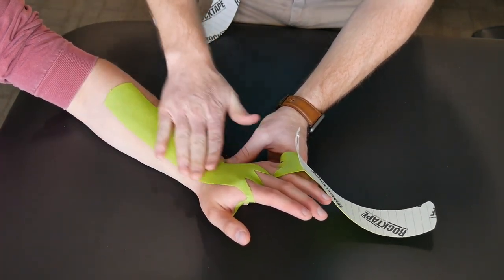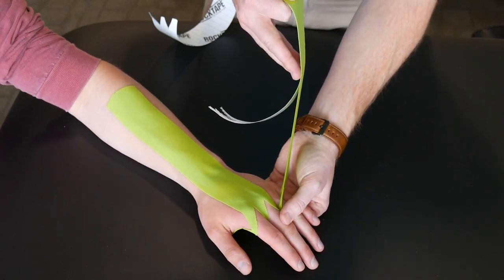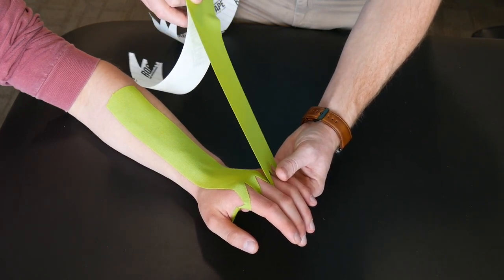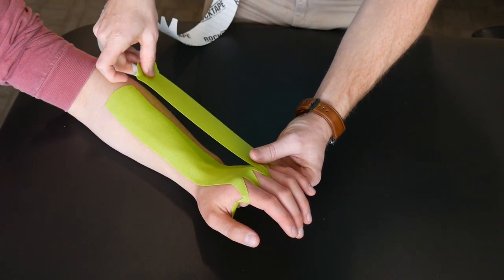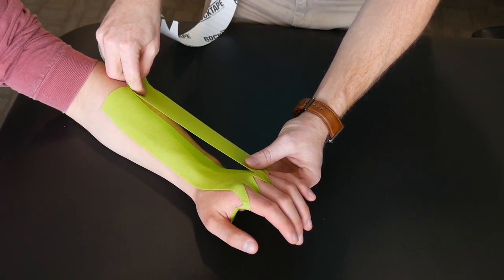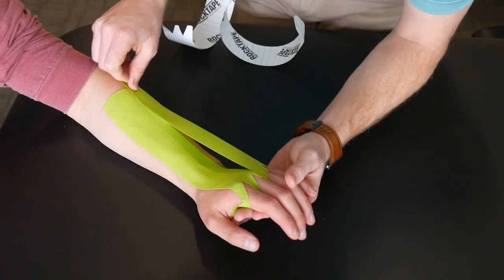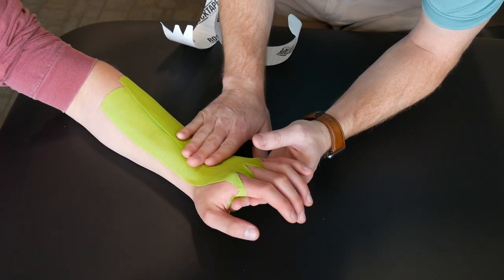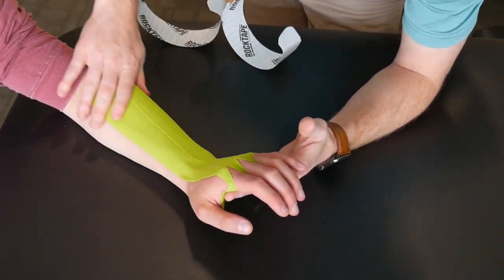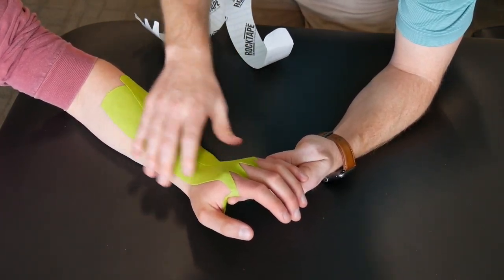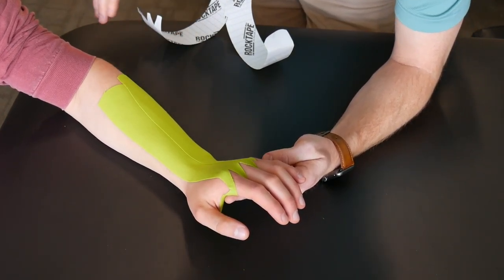Make sure you rub it in well. So again, just kind of support that wrist as you're doing this just so they don't go back into that neutral position before you get your other piece of tape laid down. So again, holding them in slight extension, pull the back of that tape off, leave an inch or so as a handle, pull that, go ahead and put that on the skin. The last inch or so of that should not have any stretch on it and then you'll kind of take that and push it down onto the skin. Really important to rub that in really well. And there you have it.